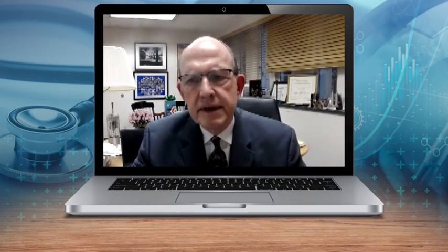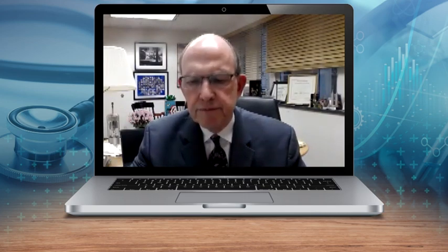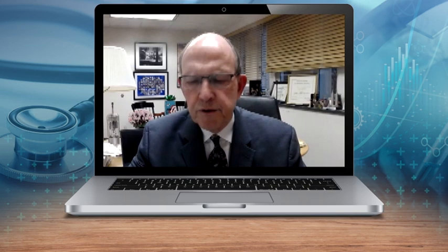What is proton beam therapy? Proton beam therapy is a radiation treatment that precisely delivers a beam of protons to disrupt and destroy tumor cells. Compared with traditional radiation, protons have unique properties that allow doctors to better target radiation to the size and shape of the tumor. The proton beam kills the tumor cells and spares more of the surrounding healthy tissue.